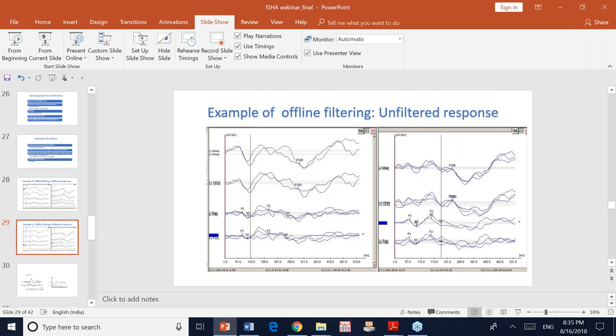Do you think somebody who's sweaty versus not sweaty, you're saying it's physiological? Yes. Actually, it does make a difference, because it's said that when there is a lot of sweat, the skin potentials increase. So skin potentials can also interfere with the results, and sweaty versus non-sweaty can make a difference in the result. So you would suggest that the person shouldn't be sweaty, so you put them in an AC room and do the test. Yes. Keep them cool.